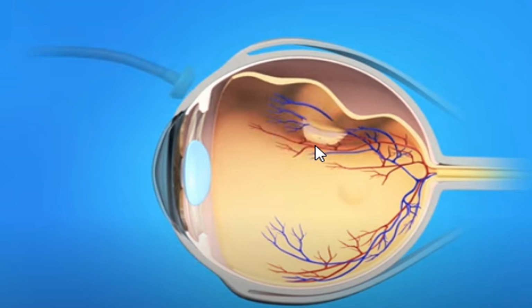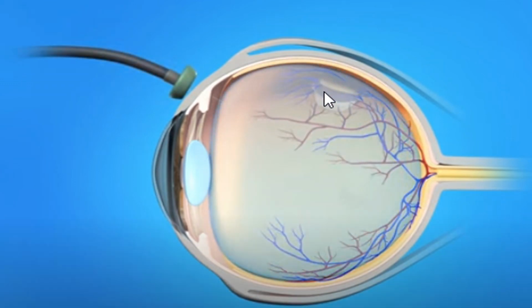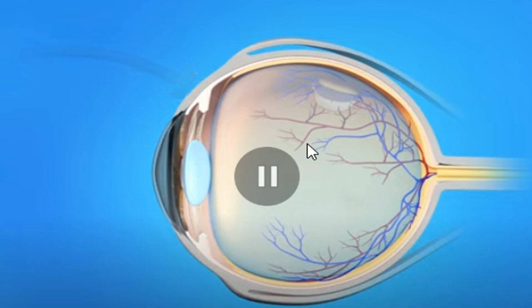Okay, so here we are injecting whatever, like silicone here. It's probably a silicone oil, and actually silicone is one of the most commonly used substitutions after vitrectomy because it has many benefits and somehow fewer complications than other options. Okay, so now we have used the silicone, and the silicone probably will be removed after 6 months. And in some cases actually we leave the silicone oil like forever, like in cases of recurrent RD or in single eye, according to the surgeon's judgment and what he has seen during the operation.